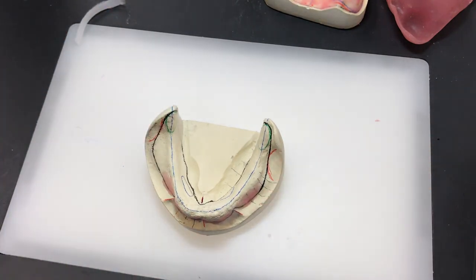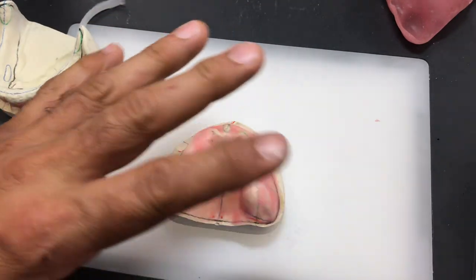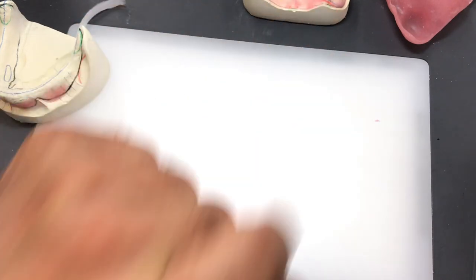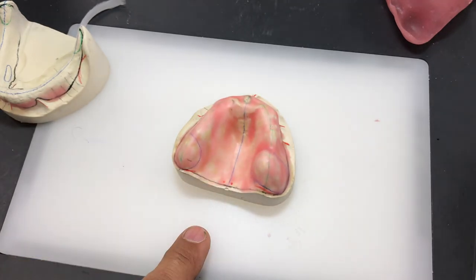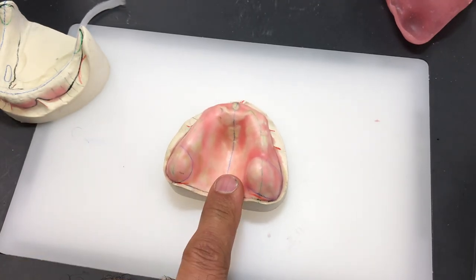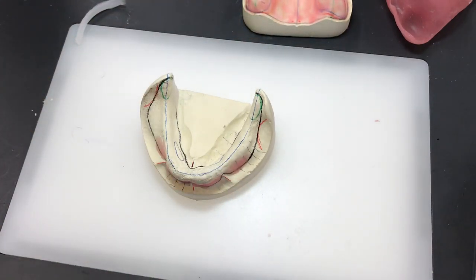The only difference now becomes using a wax spacer versus the fine film of wax that we applied over the whole maxillary cast. So we're going to do it a little bit differently. And because we're doing it differently, how this custom tray with a wax spacer is used in the clinic for final impressions, certainly for the border molding, is going to be a little bit different.